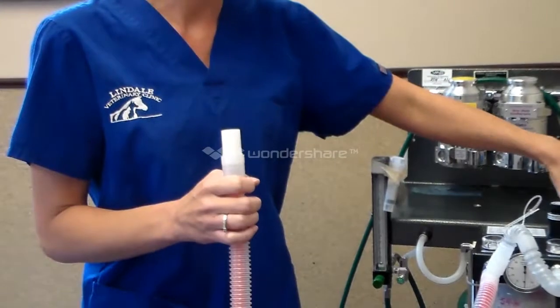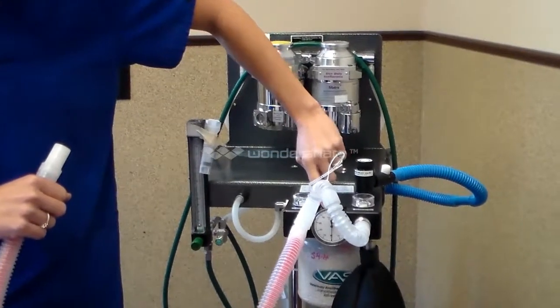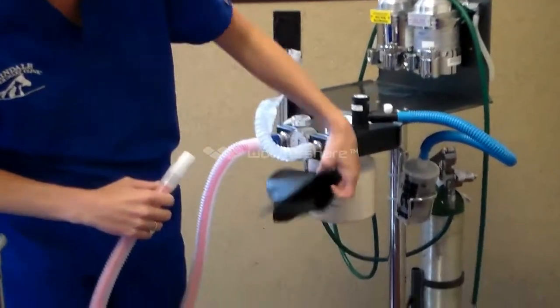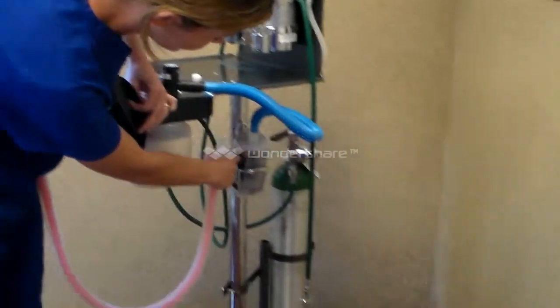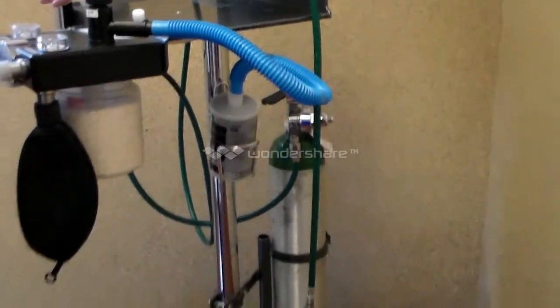Once they exhale, it comes back through this tube, through our unidirectional exhalation port. This manometer here keeps track of the amount of pressure that's in our system, so we keep an eye on this as well. This is, by the way, a rebreathing system. Once our patient exhales, it comes through our scavenger system here. We have both a soda lime canister, which helps to absorb excess CO2, as well as a charcoal canister here to help get rid of some of those waste anesthetic gases.